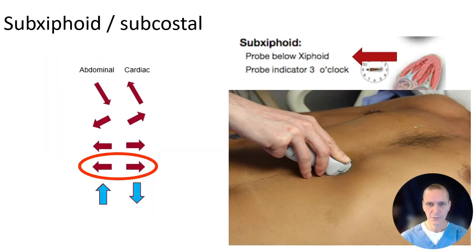After the apical four chamber, the indicator is staying in the same general direction, and you come from the apex and just move under the subxiphoid. I have found the way that works the best, if you watch the EFAS lecture, you can roll through the liver to see the heart. I have found if you just kind of visualize where the heart is, pretend your probe is like a flashlight and try to shine the light on the heart, generally it will come into view.